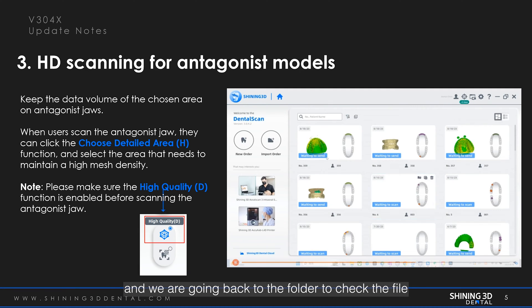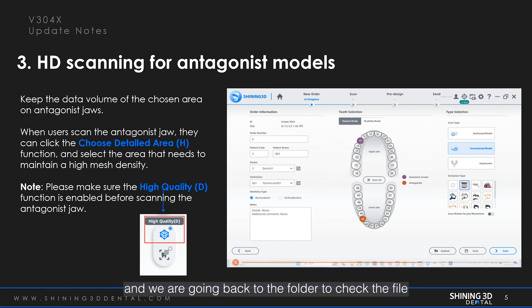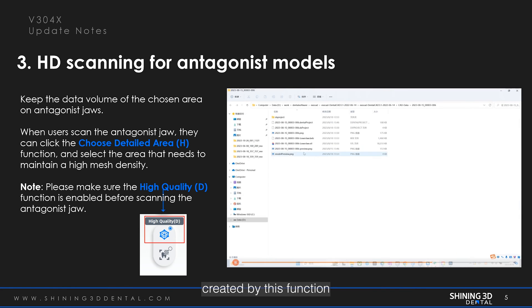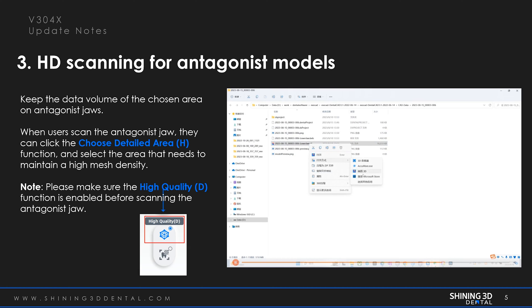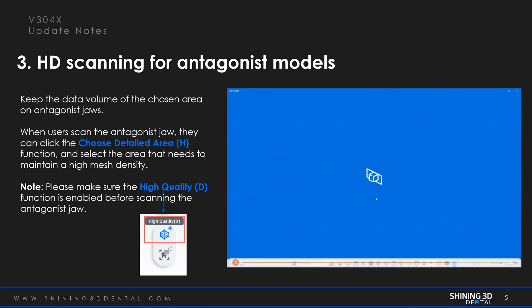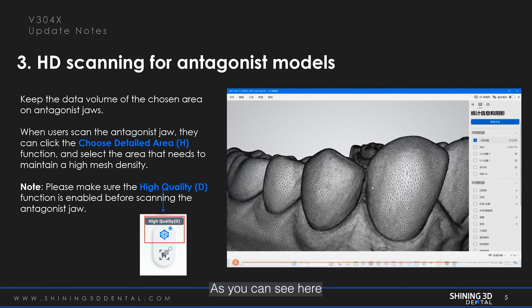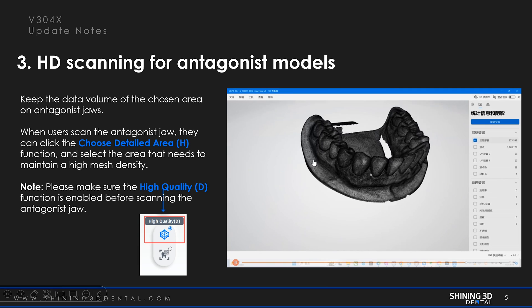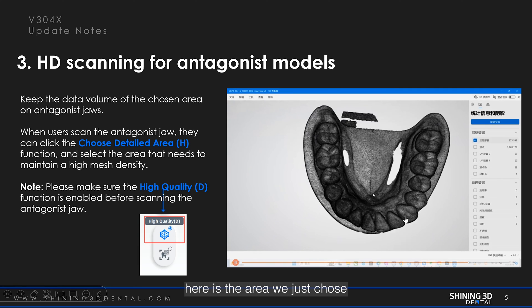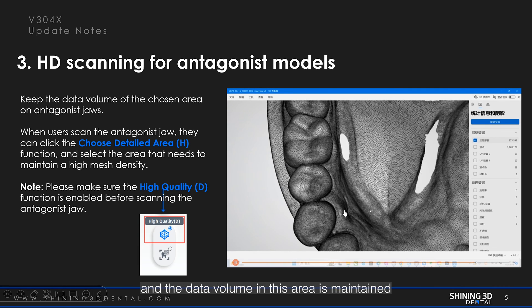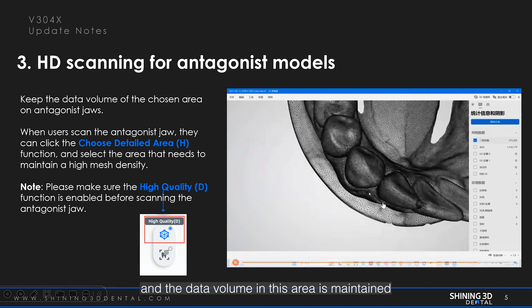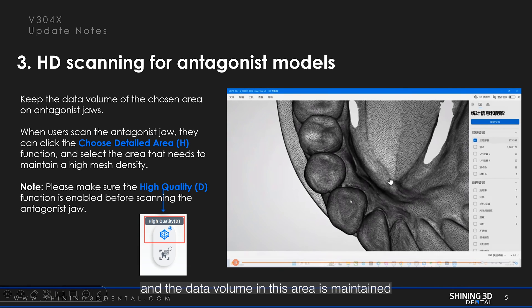We are going back to the folder to check the file created by this function. Here is the area we just chose, and the data volume in this area is maintained.